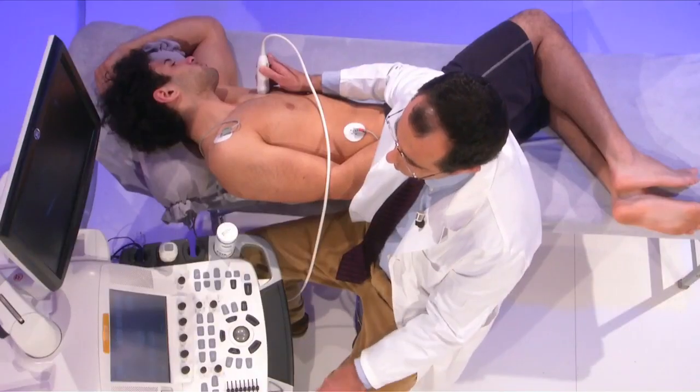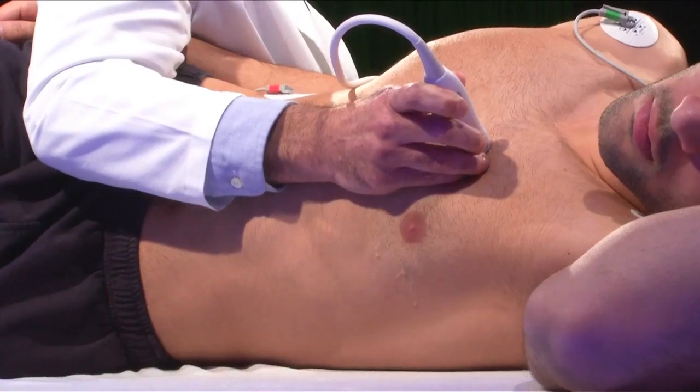What we are going to do today is to learn how to perform an echo in a hypertrophic cardiomyopathy patient. We are going to try to do it in a step-by-step approach in a clinically integrated way.